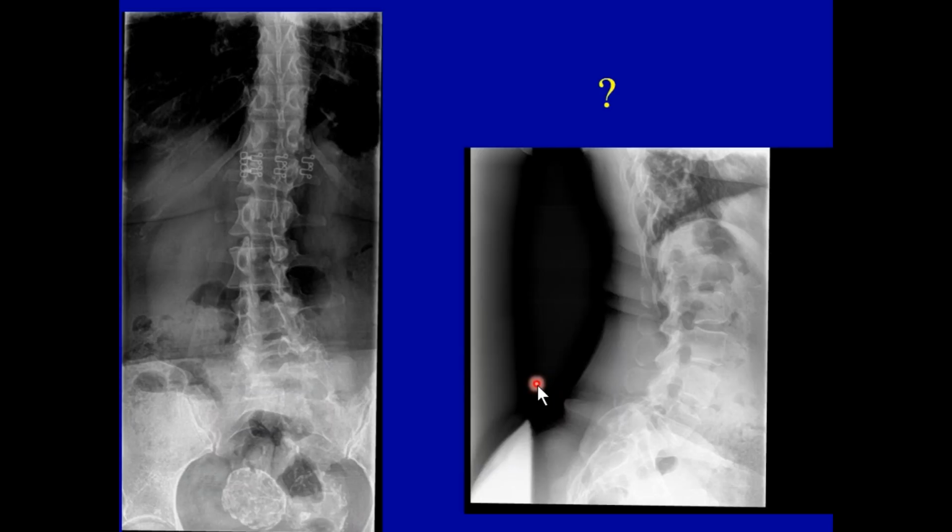This should be of interest to female patients, because female patients get a history of uterine fibroids. This is an example of one, not only one, but two. And I'm looking at this, guessing close to 5 centimeters in size.